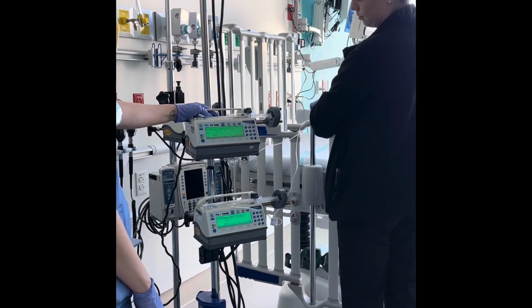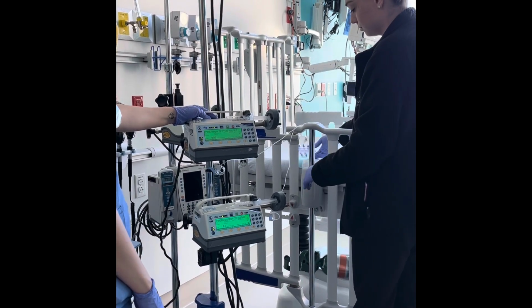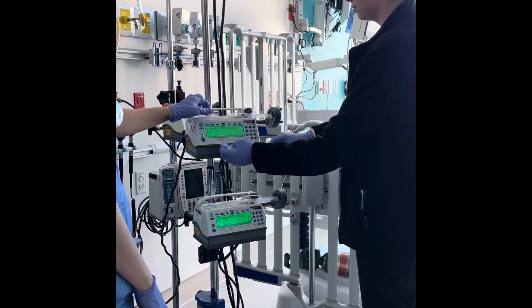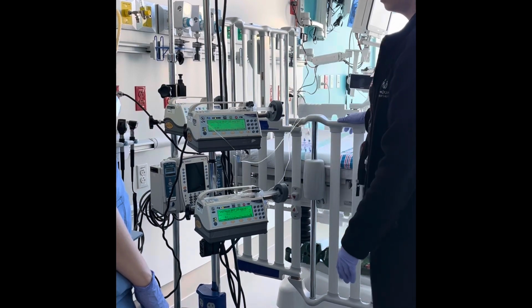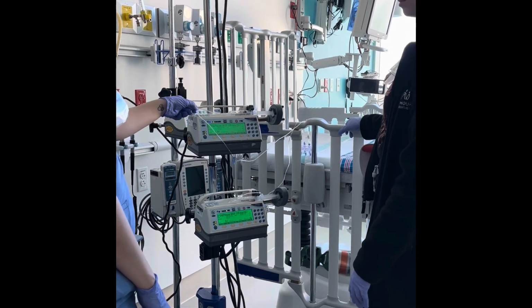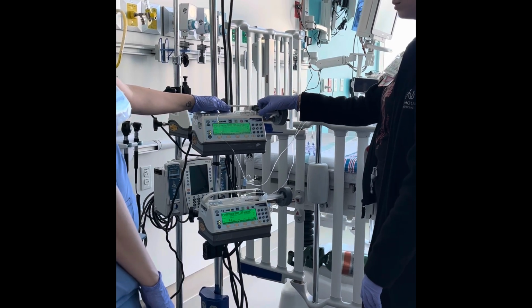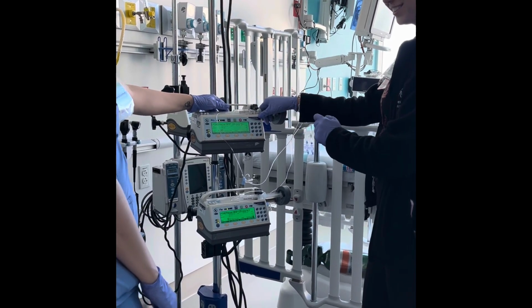We should have an empty port on the manifold, or an empty bifuse, trifuse, or quad fuse, to attach the new syringe and tubing. As a reminder, we're using filtered tubing in our unit. Do you want to double verify this?